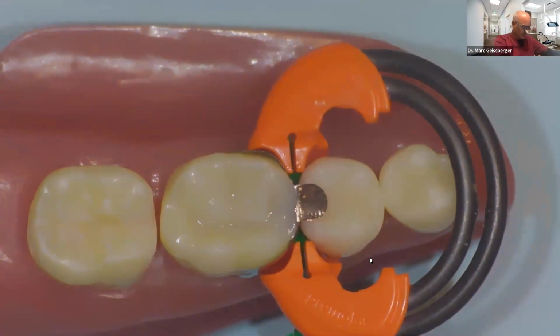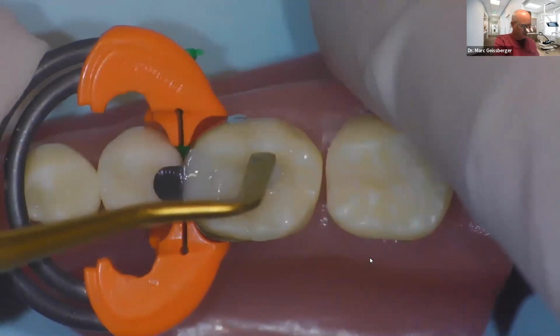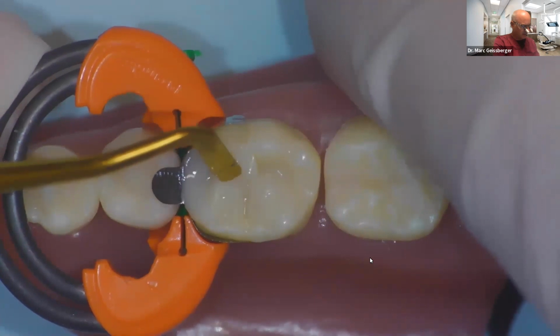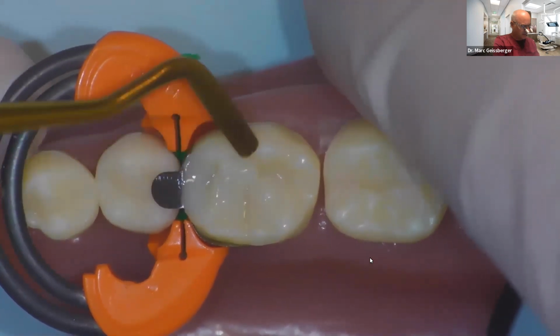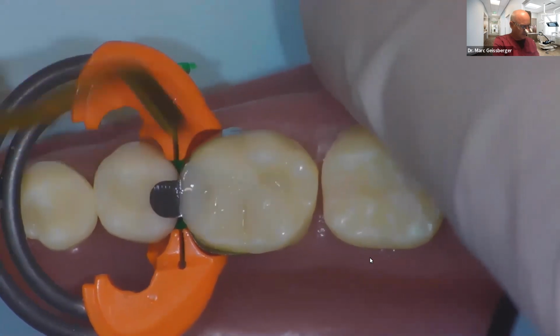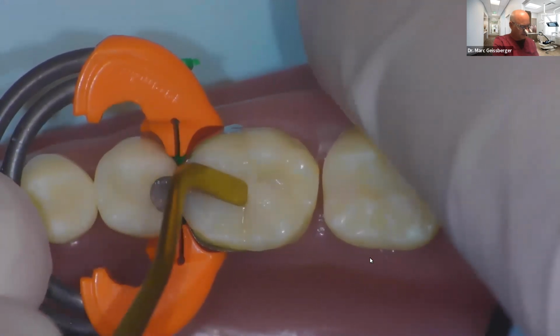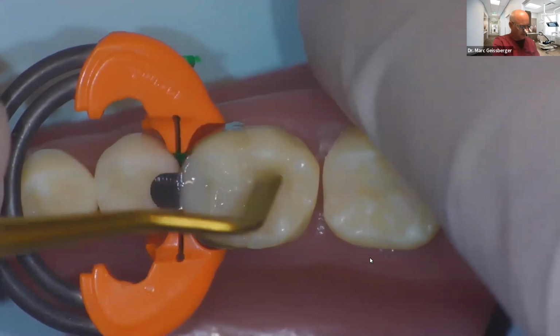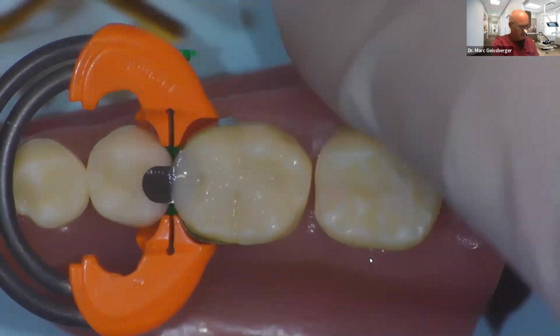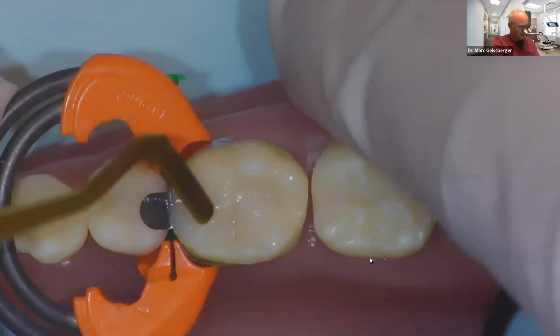I'm not putting composite now on top of itself. I'm putting it next to itself. So now if you think about it, that distal lingual cusp just got another 5 seconds of curing. I come in here now on my mesial buccal, place my composite. And when you first start doing this and practicing, likelihood is you're going to overfill certain areas. You're going to take too much composite into certain areas. And if that happens, it's not the end of the world like I just did there. I can just pull that off. And now I'm going to taper that composite in there. I'm going to leave that nice mesial fossa.